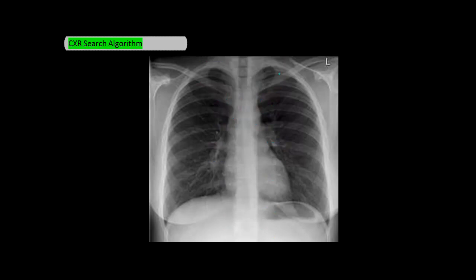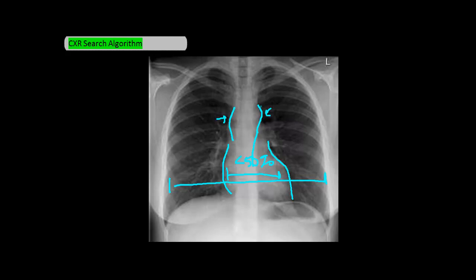For C, or cardiac, you want to look at the borders of the heart and make sure both the left and right borders are sharp. The maximum width of the heart should be less than 50% of the maximum width of the chest — I'm showing you those measurements here. You should also be able to see the aortic knob and the descending aorta going down. The borders of the mediastinum should be sharp and not enlarged. The hila are here and here, and they usually look a bit fuzzy, which is normal.